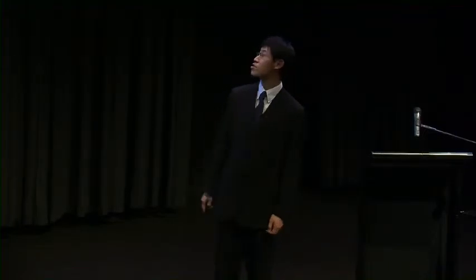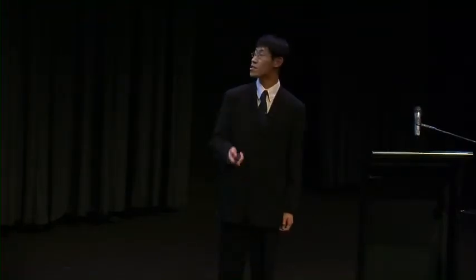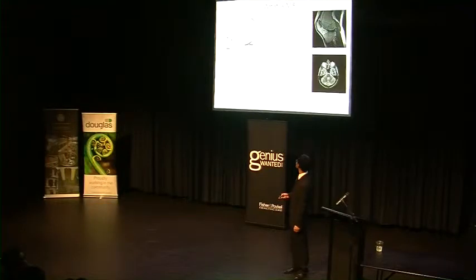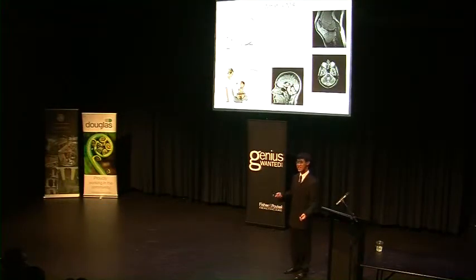So what is MRI? MRI, or magnetic resonance imaging, is a medical diagnostic imaging technique that allows clinicians to see cross-sectional slices of the human body. Perhaps you've even been inside an MRI scanner. Interestingly, we can also use MRI to measure blood flow.